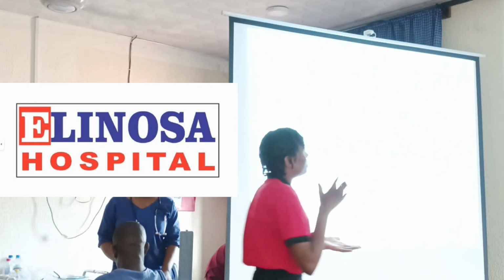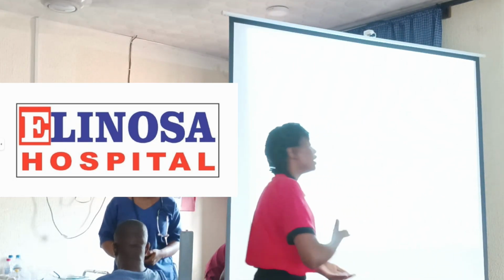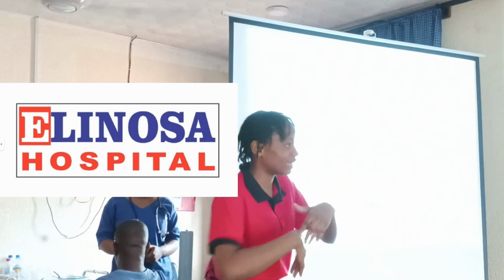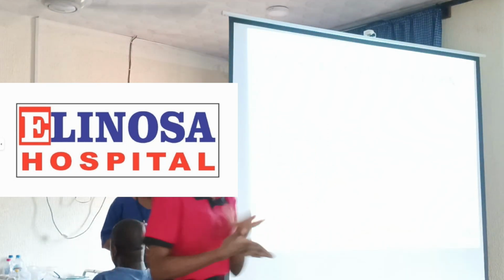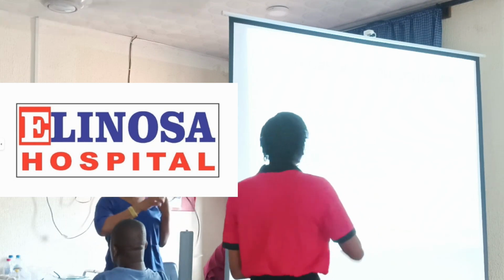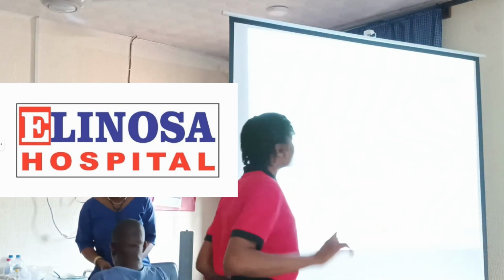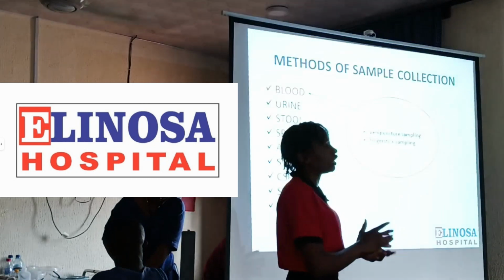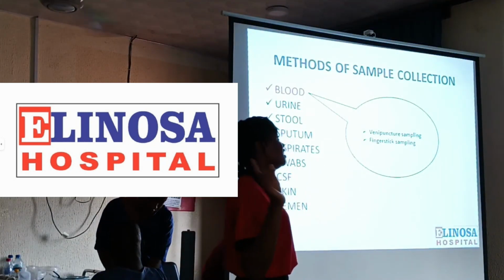Then we also have the midstream urine, collected from the mid portion of the urine. The patient is asked to pass out the first part of the urine, then pass out the middle part inside the urine container, and then pass out the other part into the toilet. You understand? Then we also have early morning urine. Early morning urine is the best urine to be used for any urine analysis. Why? Because it is more concentrated and it gives the medical laboratory scientist or technician the best of the information we need for the diagnosis of disease, as the case may be.